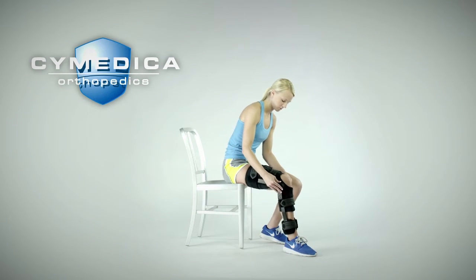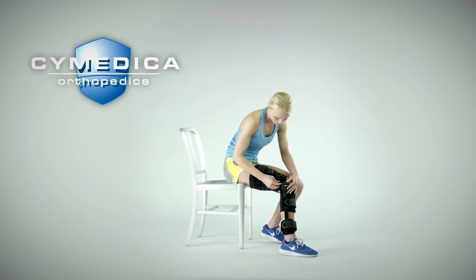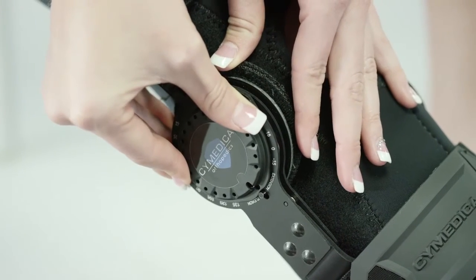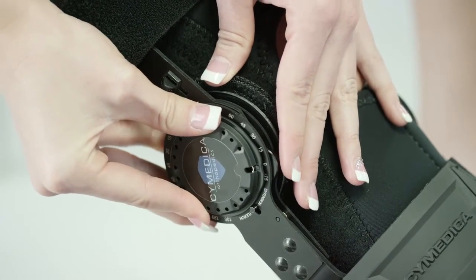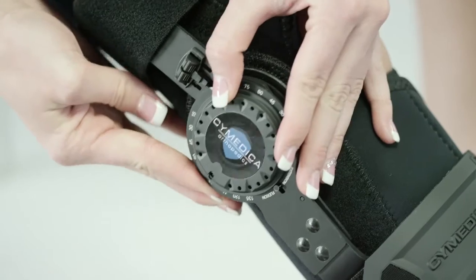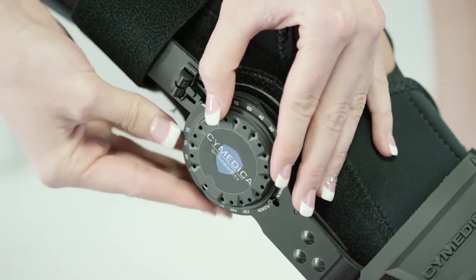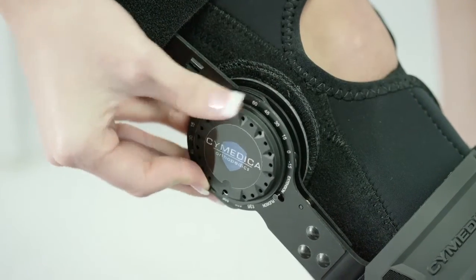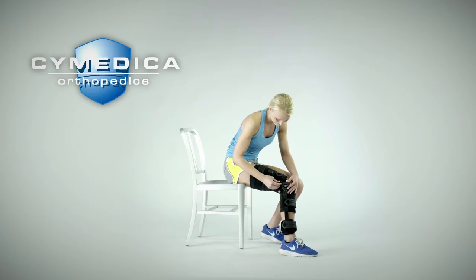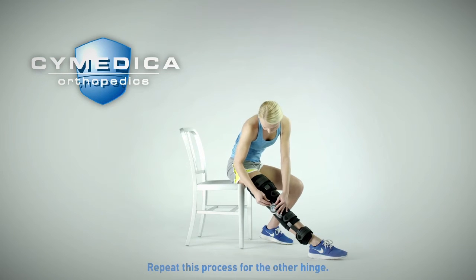To remove the range of motion limits, reverse the setting process. Rotate the hinge dial toward extension and pick up the locking disc. Dial the disc to minus 15 degrees and push the disc back in until the dial releases the disc. Rotate the hinge dial towards flexion and pick up the disc. Dial the disc to 135 degrees and push the disc back in until the dial releases the disc. Turn the dial back to the lock position. Repeat this process for the other hinge.